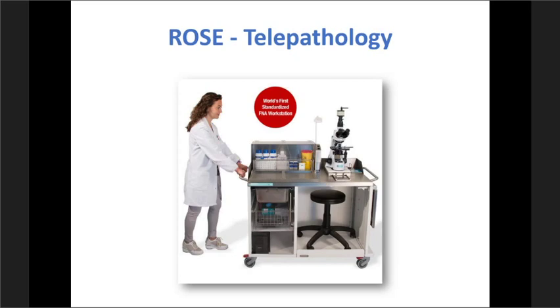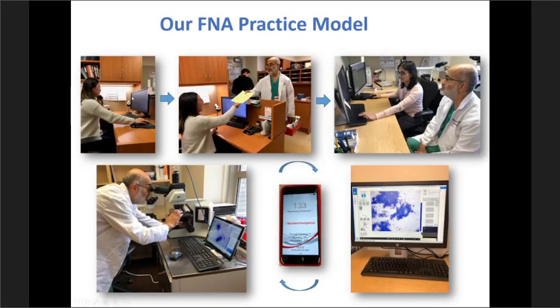So when we get the call, like over here, this is the front desk, and our front desk staff receive the call. They note down the details. The details are translated on a paper onto the cytotechnologist here. This is our cytotechnologist, Behzad. He's getting all the information here. Then subsequently, the cytotechnologist, in most situations, will proceed on to inform the pathologist.